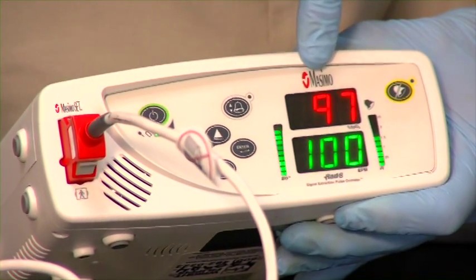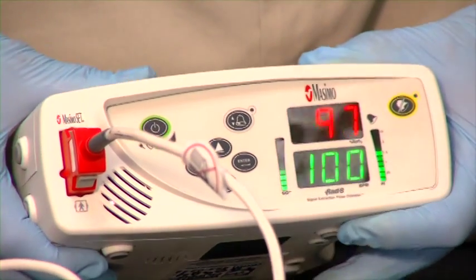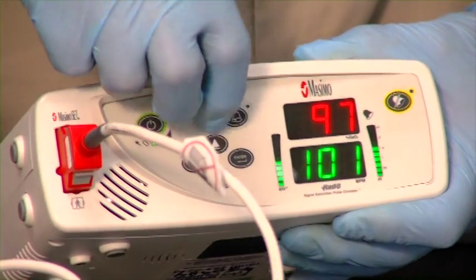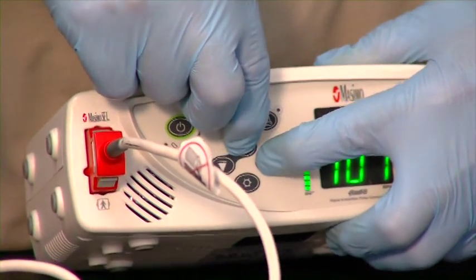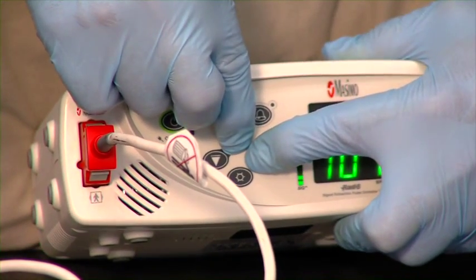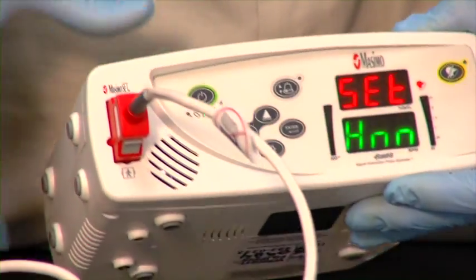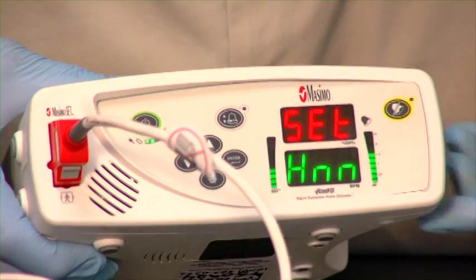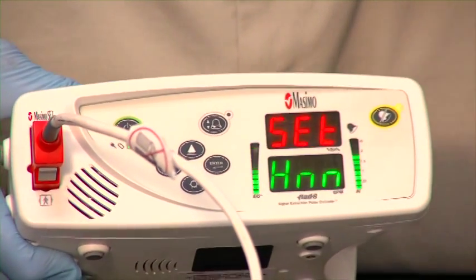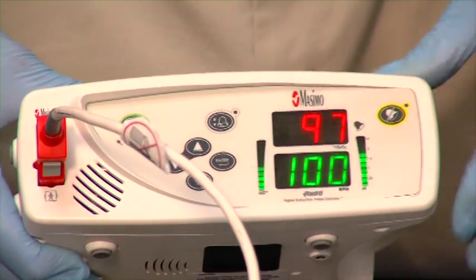Right now we're getting a 97% oxygen level and a pulse rate of 99, now 100. When we get an alarm, we can hit our alarm silencer button and that will silence the alarm for two minutes, unless the problem is corrected — then the alarm will stop.